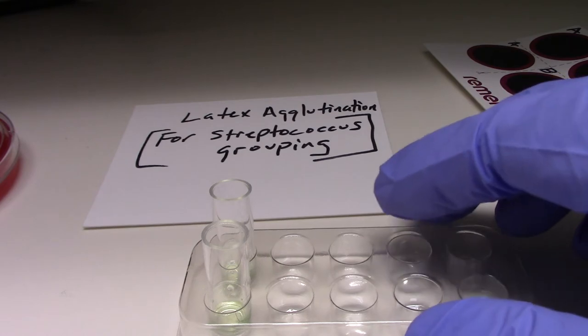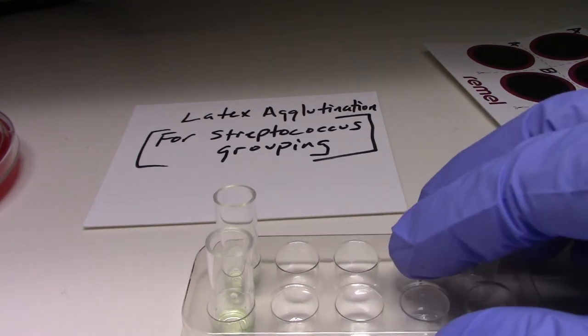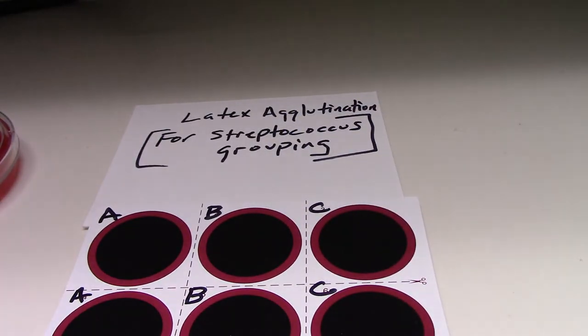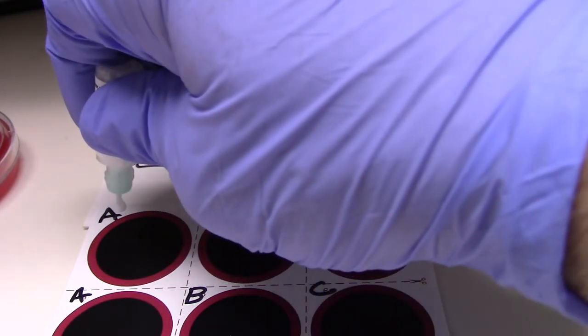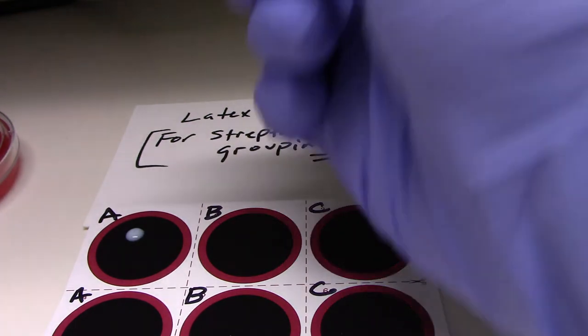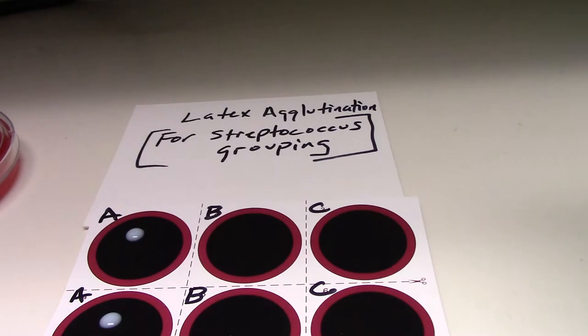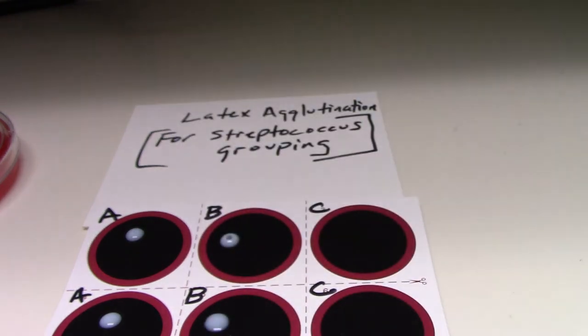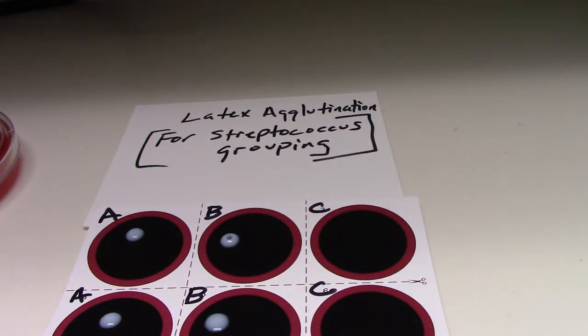And what I'm going to do is, while this is incubating, I'm going to put the latex on our card here. So we have antibody for A, latex coated, antibody for B, and a polystyrene latex, and C.